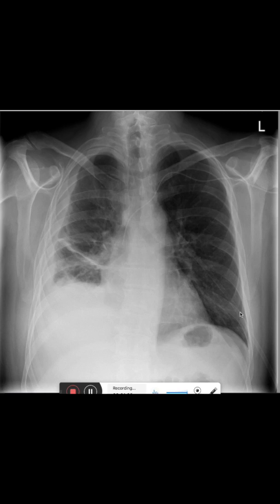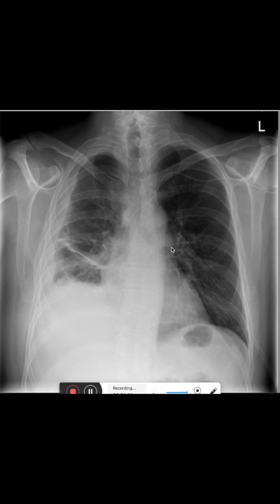We also see some degenerative changes here in the skeleton, and a little bit of these outlinings that indicate that the patient has pulmonary congestion. However, we can see a sharp line on the thoracic aorta, which shows that the retrocardial field is free, so there are no occult infiltrates.